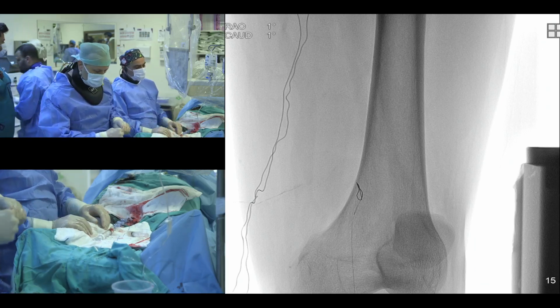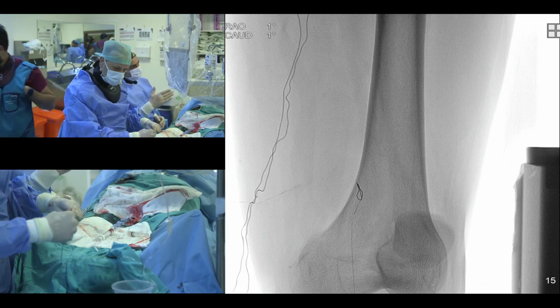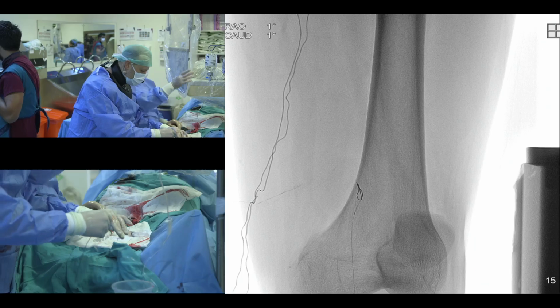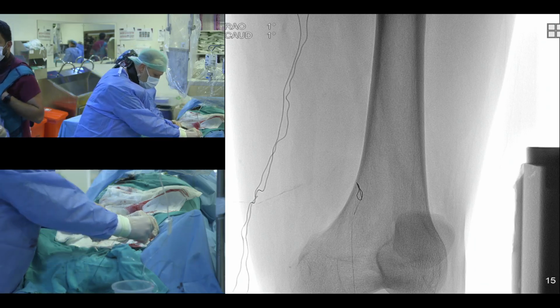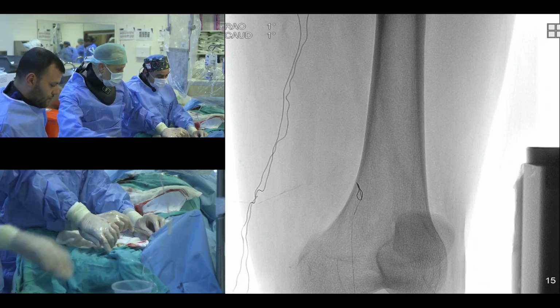I think the deep profunda artery should be protected. Yes, of course.